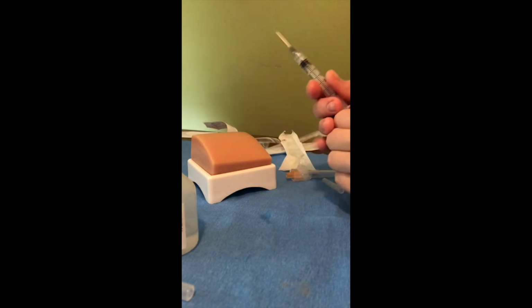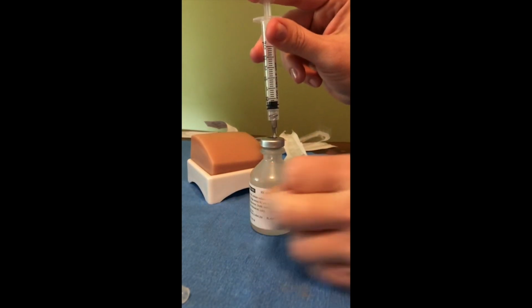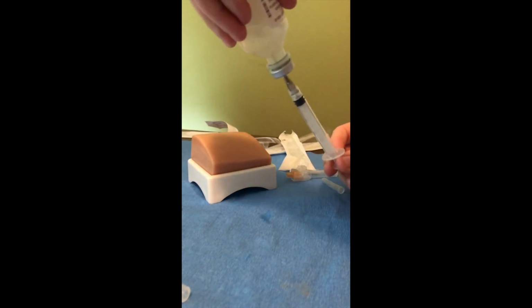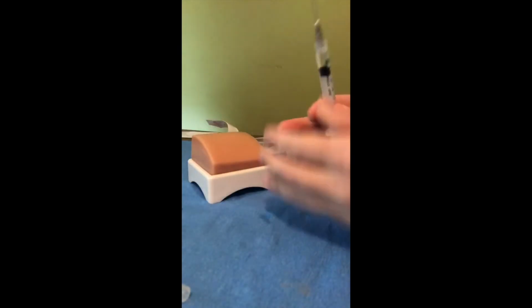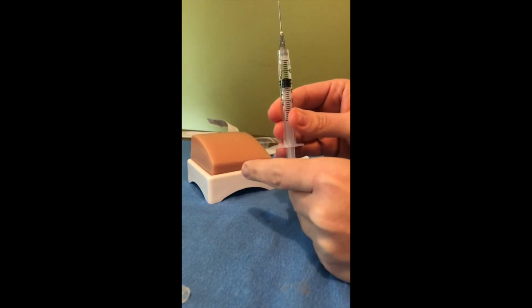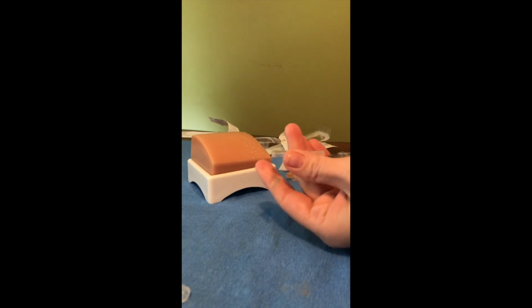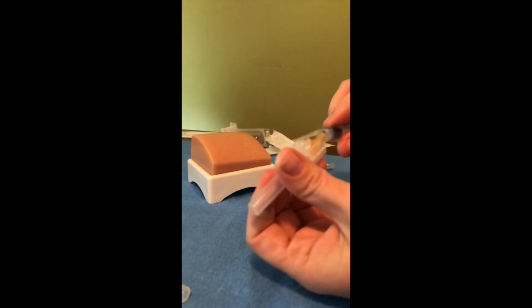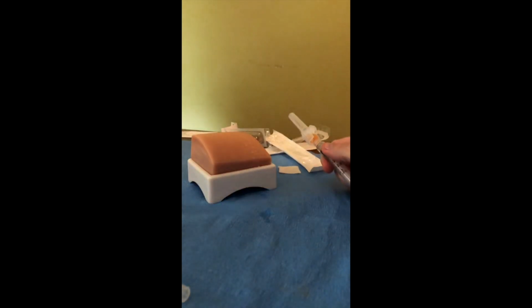Okay. I'm going to go ahead and draw up 0.5 here too. And then you're going to flip your bottle up. So that I always get a little bit more than what I need to ensure I get all the air bubbles out. This is the only time that you can recap a needle is when you're changing them and it's not been in anybody.